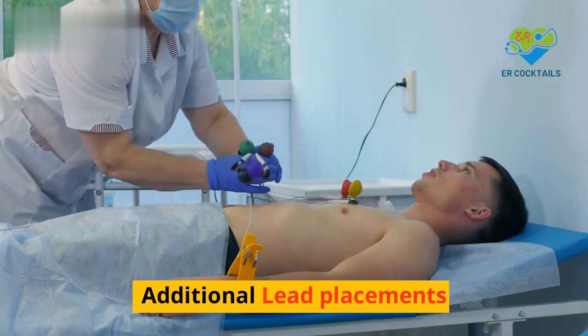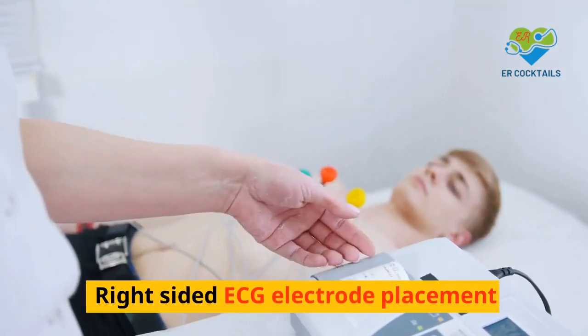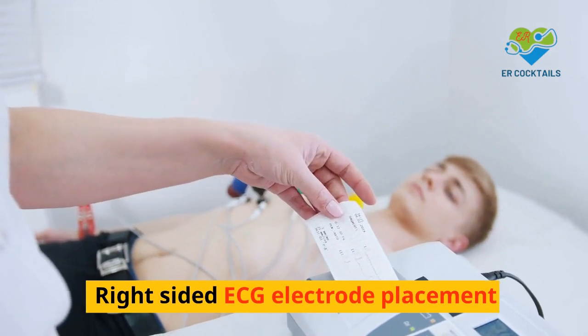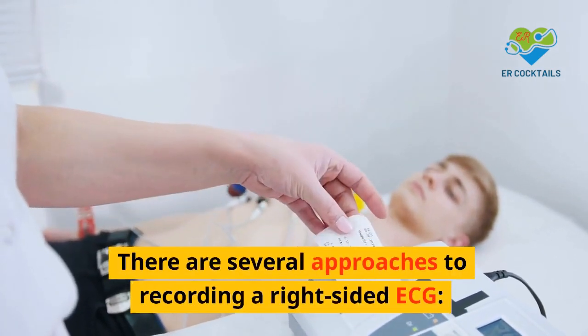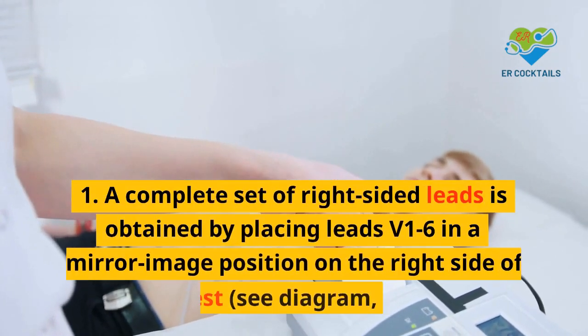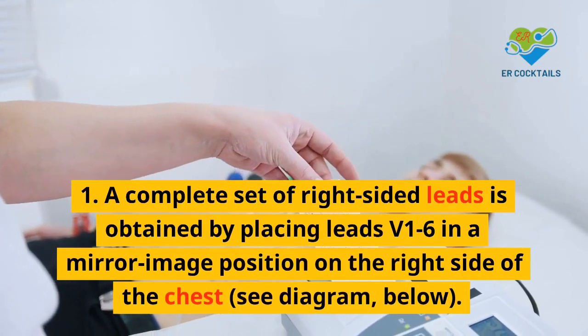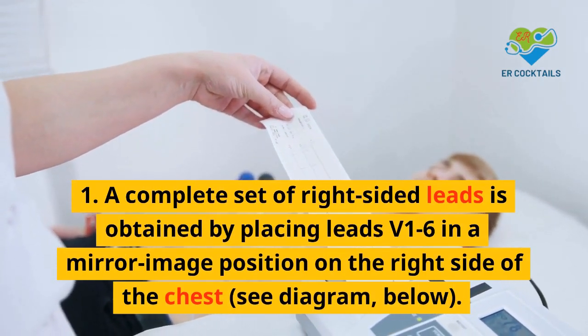Additional lead placements. Right-sided ECG electrode placement. There are several approaches to recording a right-sided ECG. 1. A complete set of right-sided leads is obtained by placing leads V1 to V6 in a mirror image position on the right side of the chest.